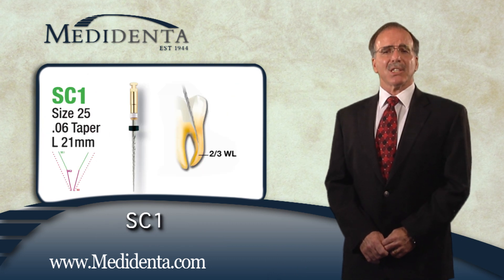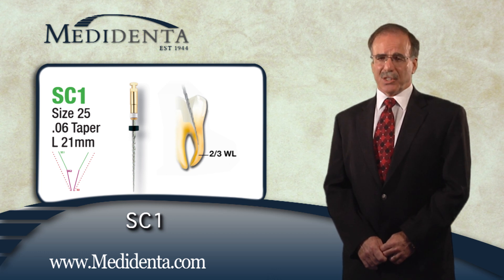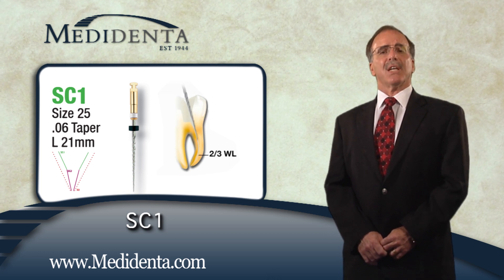After obtaining access and finding canal orifices, the coronal two-thirds of the canal is enlarged with the REVO SC1 instrument, which is 21 millimeters in length and 25 at the tip at an 06 taper.